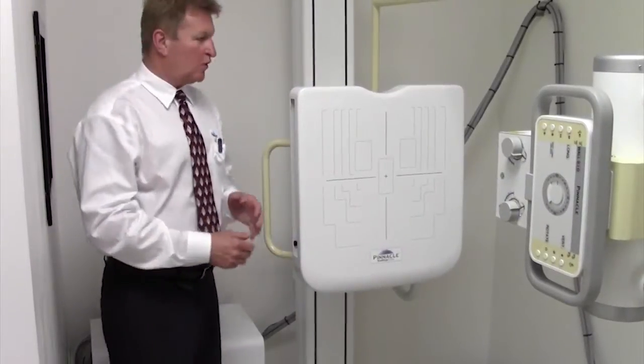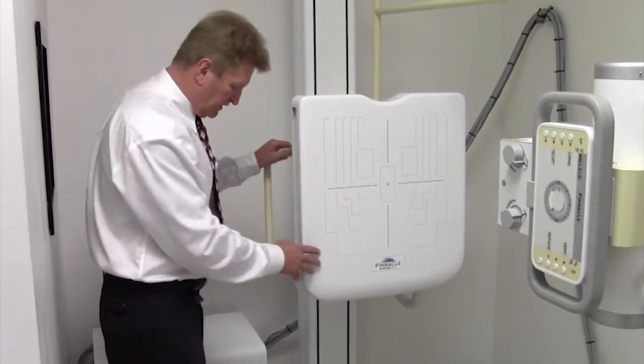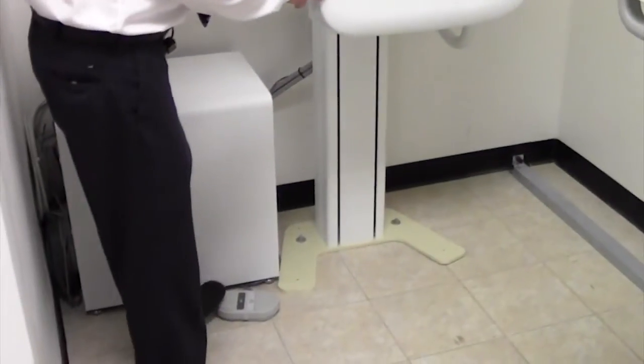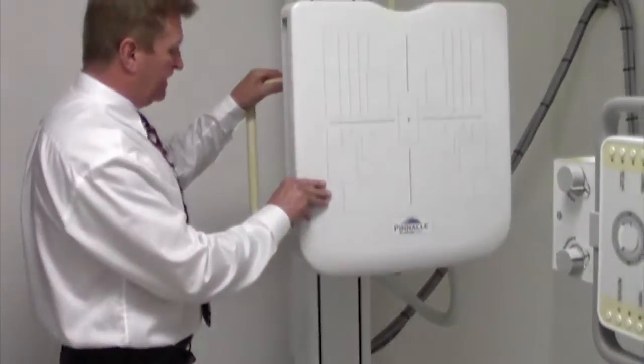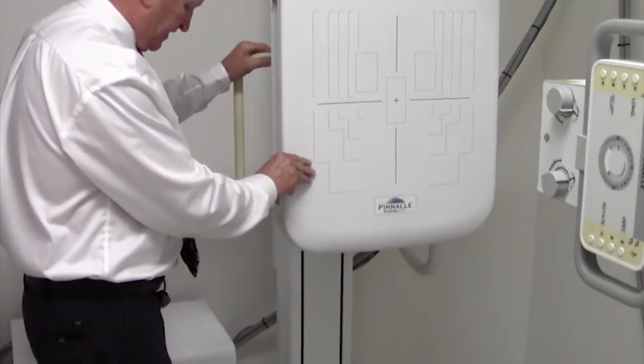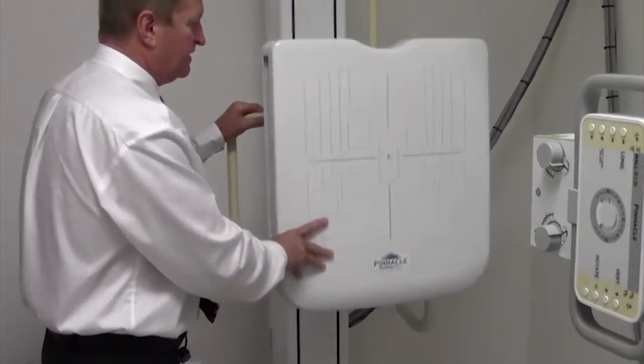To do extremities or anything tabletop, the activation foot switch is a double tap to move the wall stand. You can move it up or down and double tap to rotate the platform.